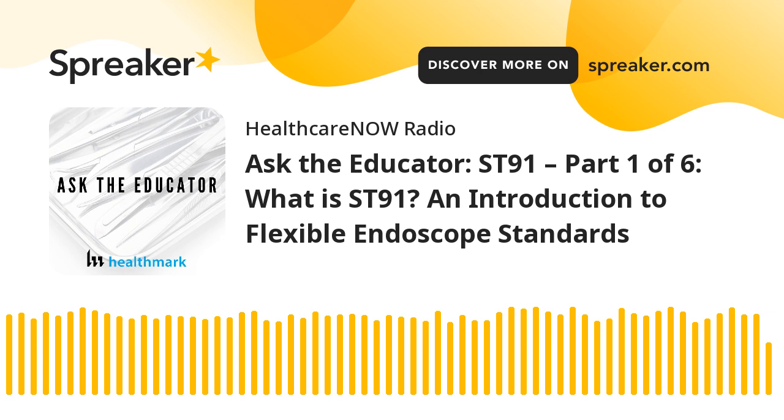But there's a little bit more wiggle room with a should, meaning that the way we say it is one way you could do it, but there may be another way to do that topic or to have another course of action that would help you comply with that indication. So should is a strong recommendation of the working group based on evidence, based on experts within the field. So really you should be doing something when you see a should.